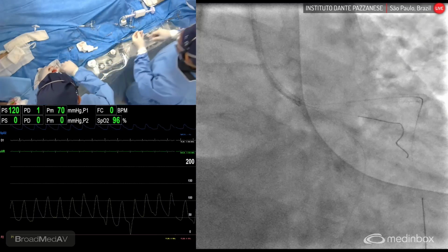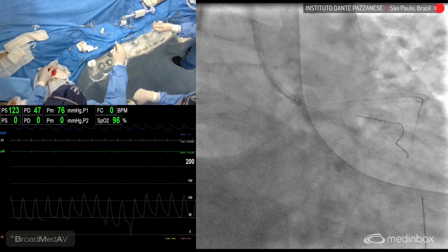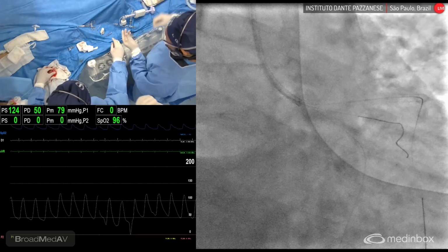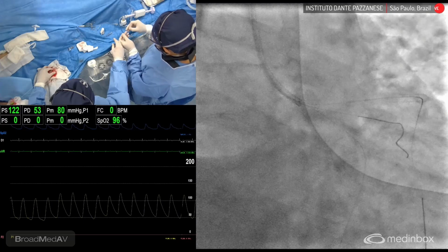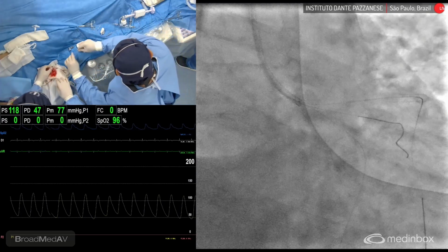And I think, Rodolfo, that if you decided to do the nano crush, the angulation is favorable, right? It's almost 90 degrees. Correct. And you can do really just enough to cover the ostium, right? Without compromising or protruding too much into the main vessel, left main to the LAD.